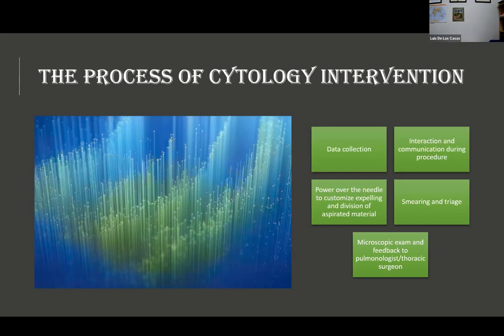The microscopic exam, if possible, needs to be done with the minimal possible noise. We are going to review that in a minute. At this point, it is important to also pause yourself to analyze what is the message you want to convey rather than describe what you see. For example, we got the lesion, looked like squamous cell carcinoma, or we got granulomas, or malignant cells are present. We need a good cell block, or what I have on the slide does not represent a tumor.